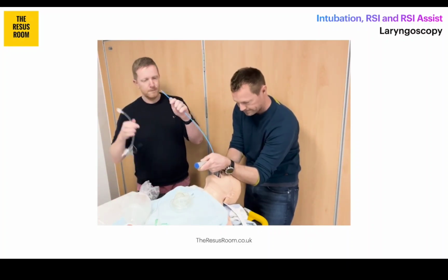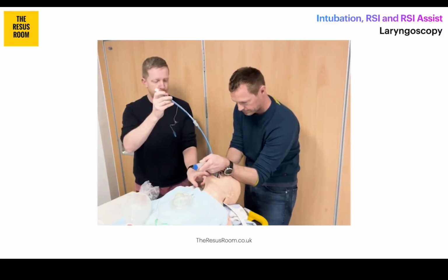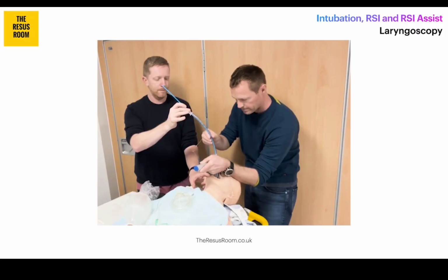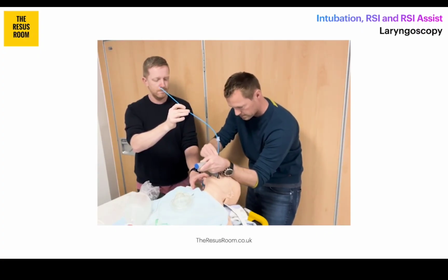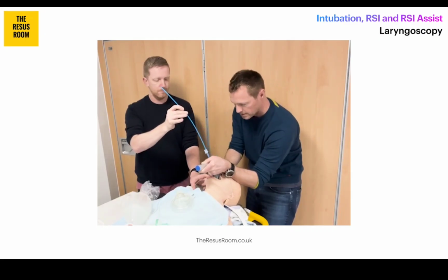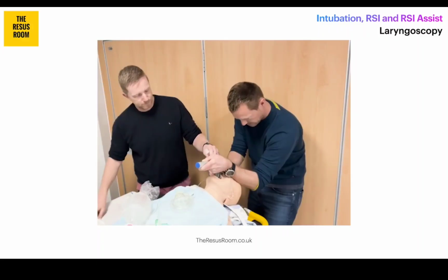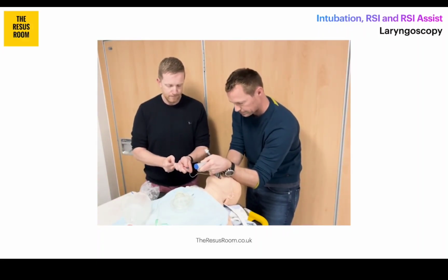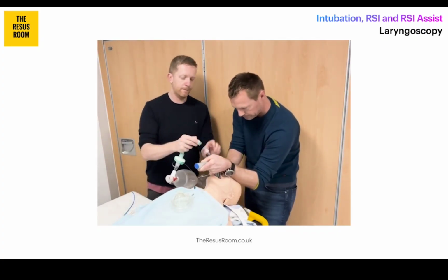Operator 1 stays eyes on the view at all times, not rotating away. Then the bougie comes through the cords, tube onto the bougie. Tube's then down into operator 1's view. Then that's inserted. It's rotated at the point of the cords, through nicely. Happy we're at the right point, not too shallow, not too deep. Bougie then comes out, laryngoscope stays in, air then goes into the cuff, nicely inflated to the right pressure.